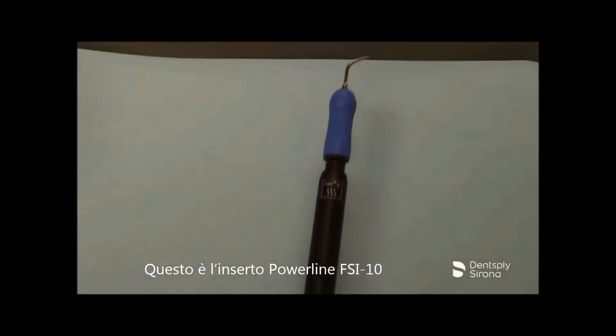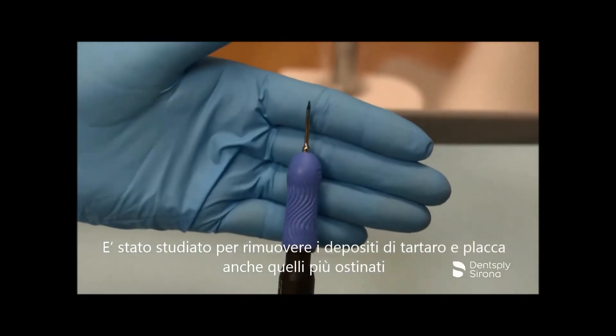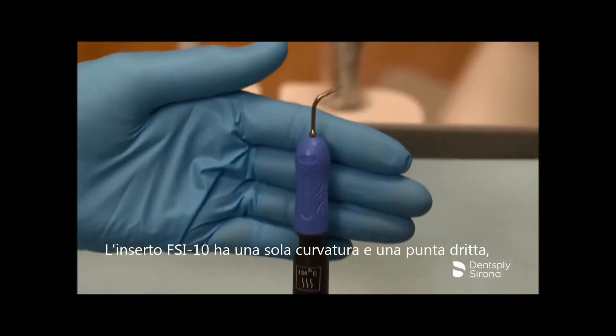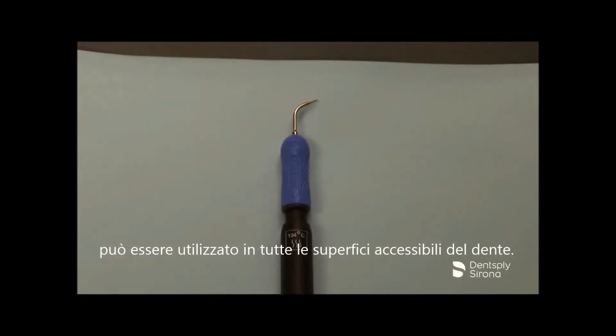This is the Cavitron FSI 10. It is designed for removal of moderate to heavy deposits and it can be utilized at all power levels. The Cavitron FSI 10 has a straight shank and can be used on all accessible tooth surfaces.